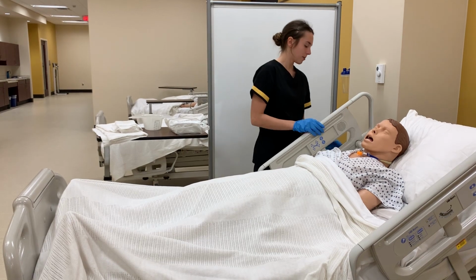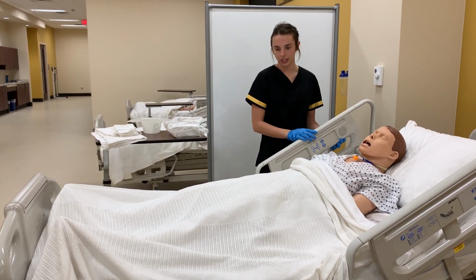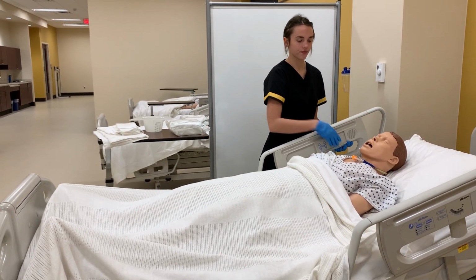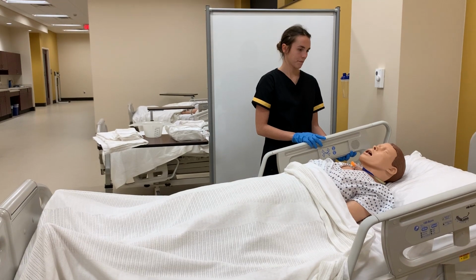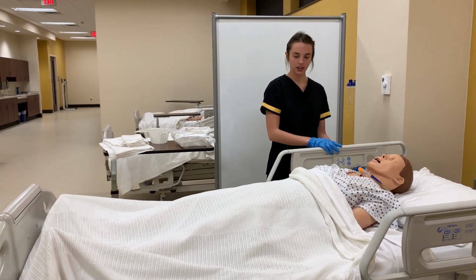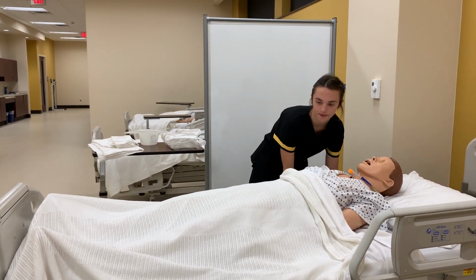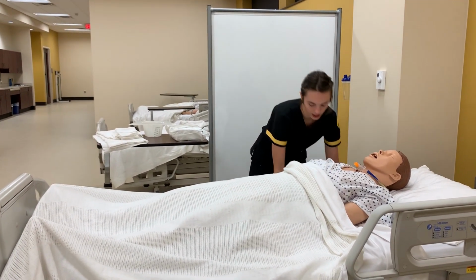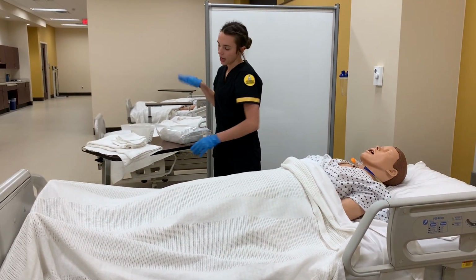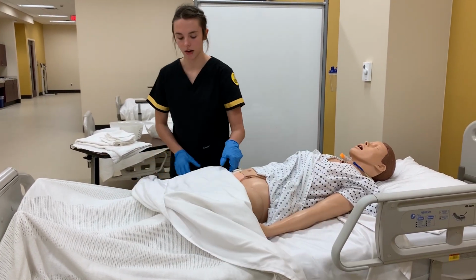I'm going to just lay your bed down into the supine position for this procedure. And we can get going. Okay, that's at a good working height. So let's put this bed rail down. And then we can get started. So I'm going to pull your sheet back, but I'm going to maintain your privacy as long as we can with this towel.